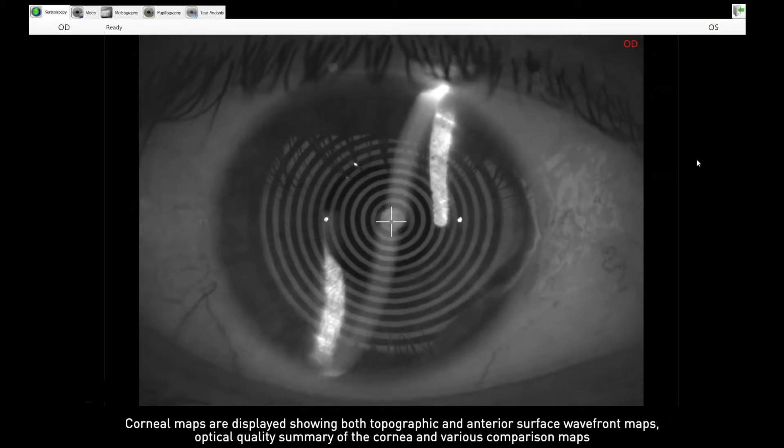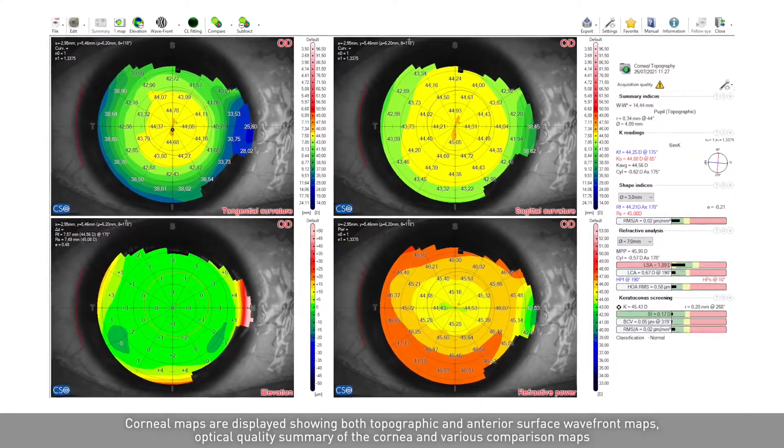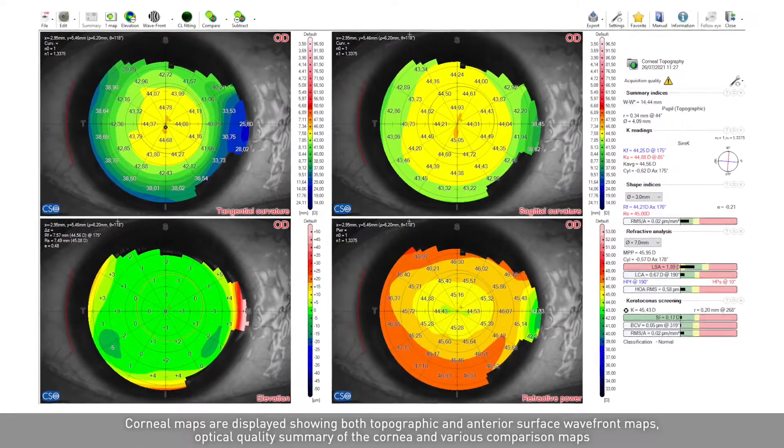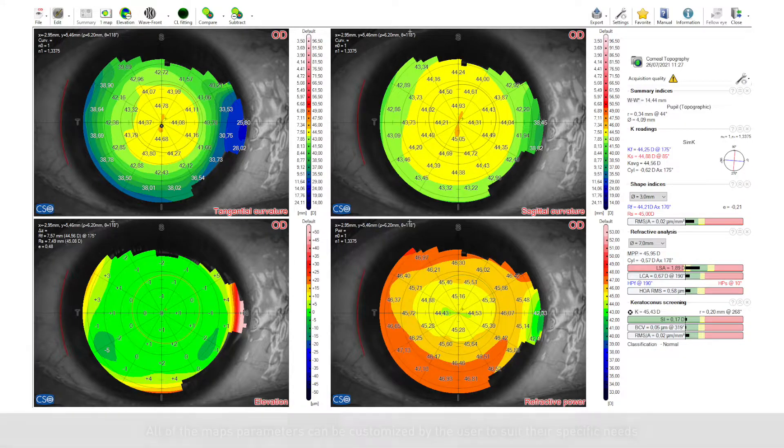Corneal maps are displayed showing both topographic and anterior surface wavefront maps, optical quality summary of the cornea, and various comparison maps. All of the maps' parameters can be customized by the user to suit their specific needs.